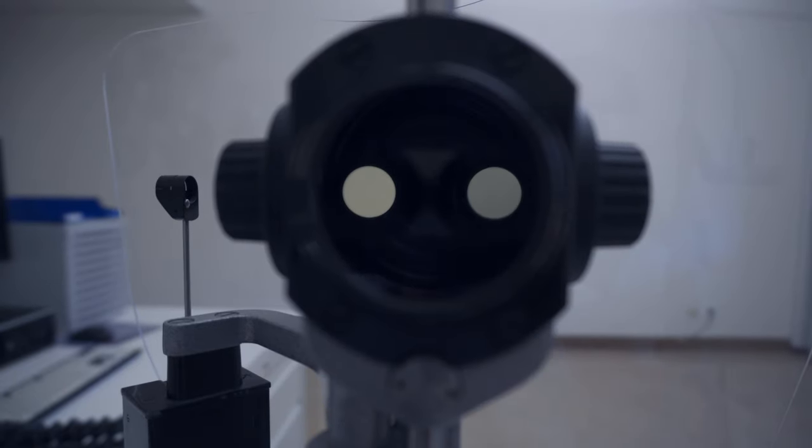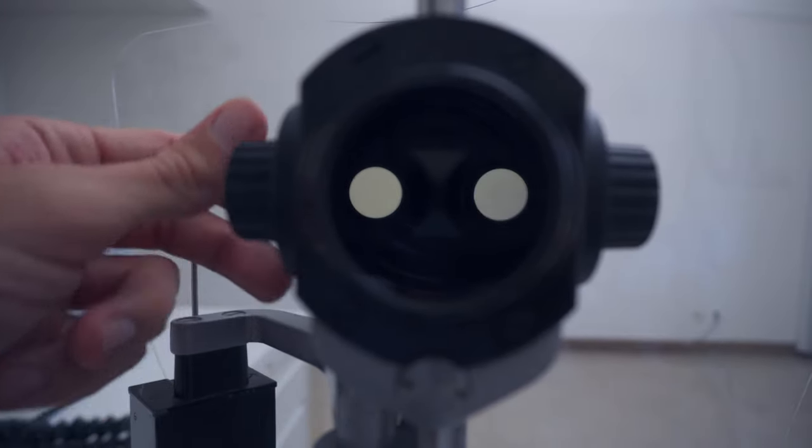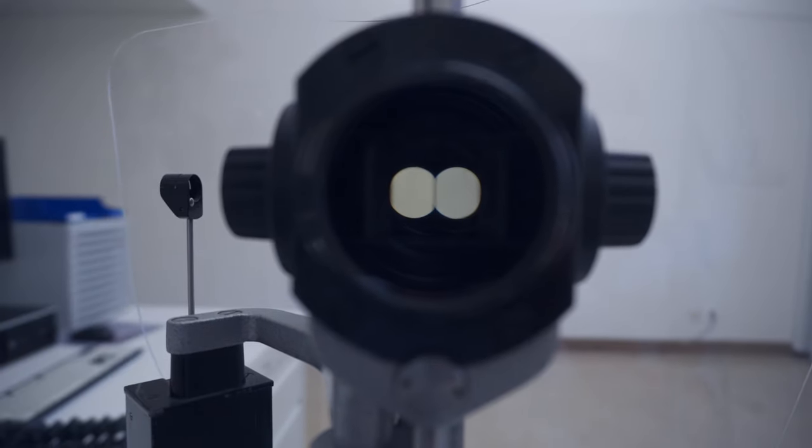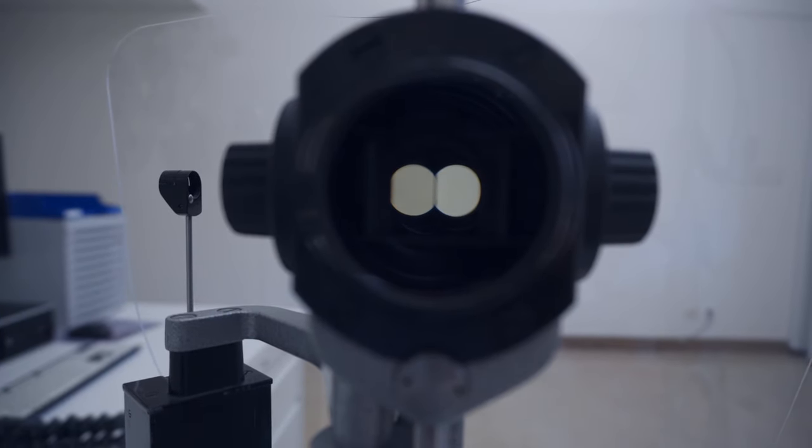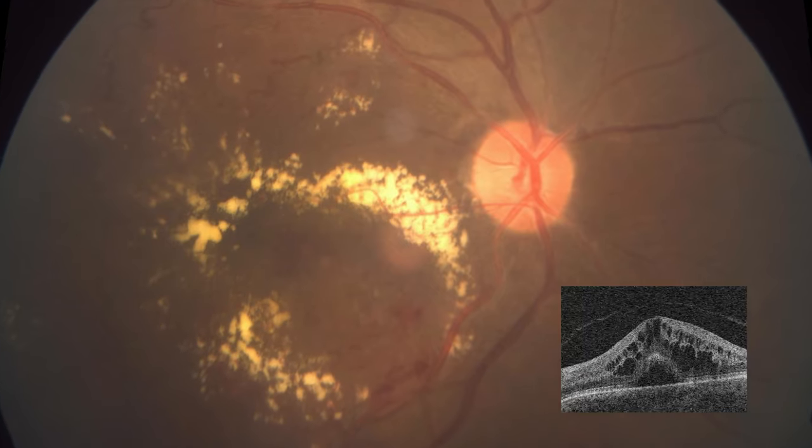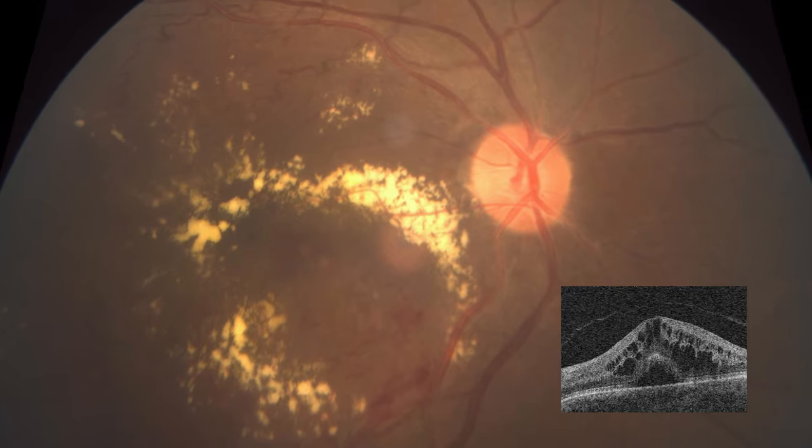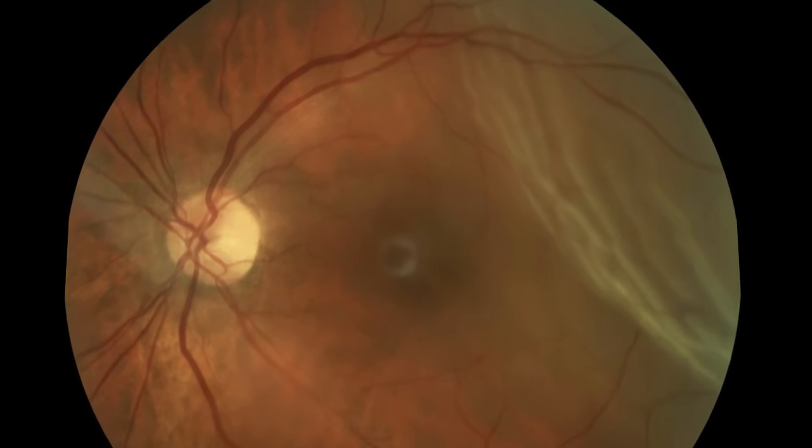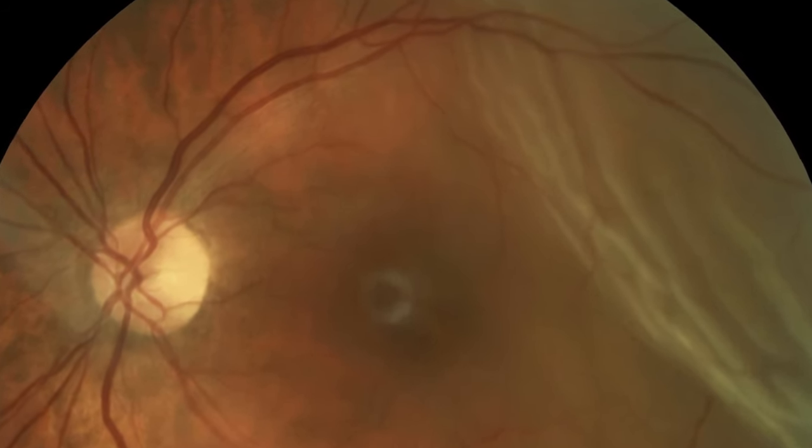This is especially important when you're trying to see a macular edema or a retinal detachment.